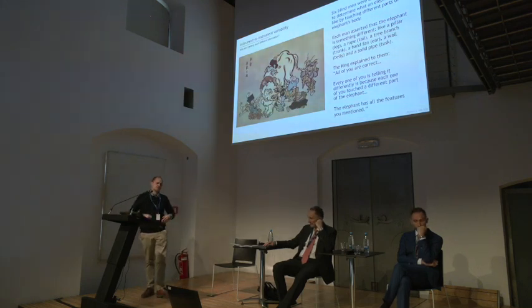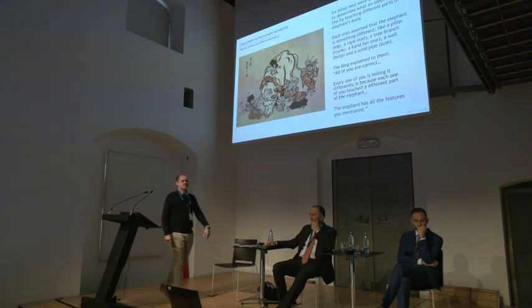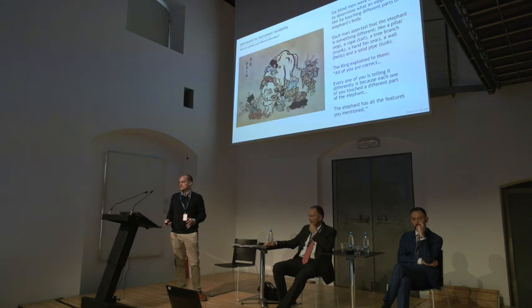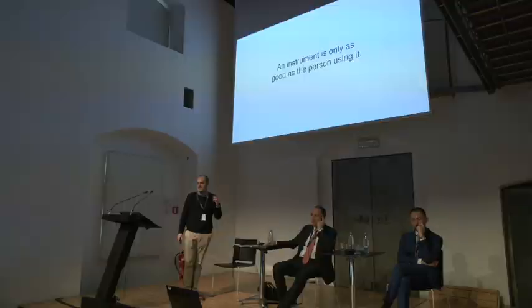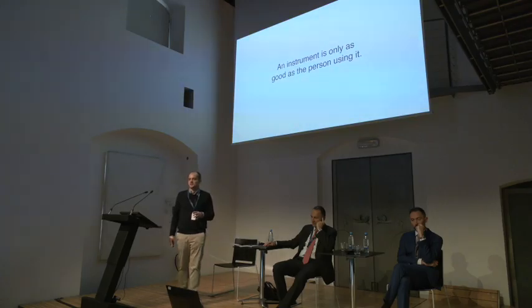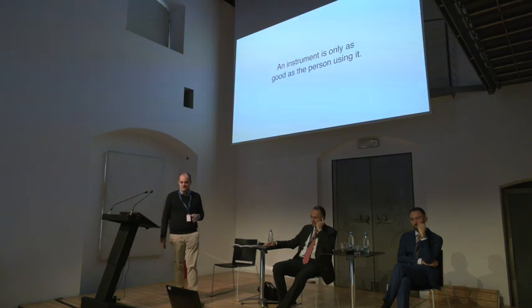We have biometers, we have keratometers, we have Placido, we have Scheimpflug, we have pure OCT, but none of them tell the whole story. So this is why it's very important in your mind to understand that it's not just mindless button pushing, but every instrument has its purpose and its designed use case.